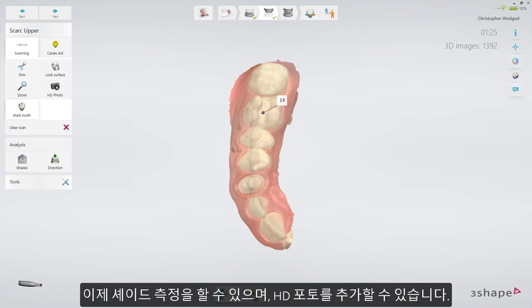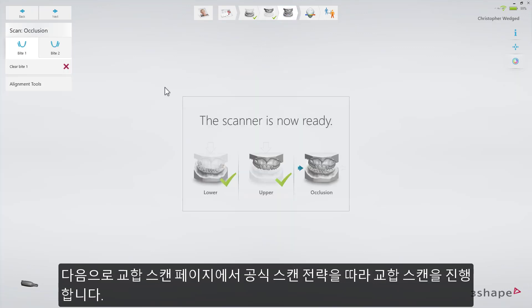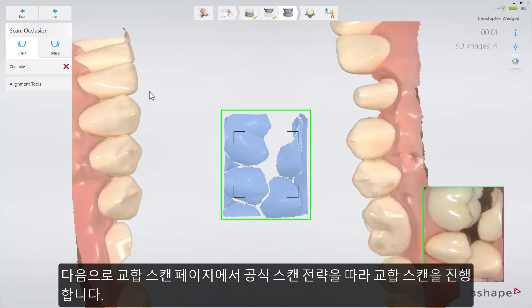Now you have the opportunity to take a shade measurement and add an HD photo. Now move to the bite scan page and proceed with scanning, following the official scan strategy.